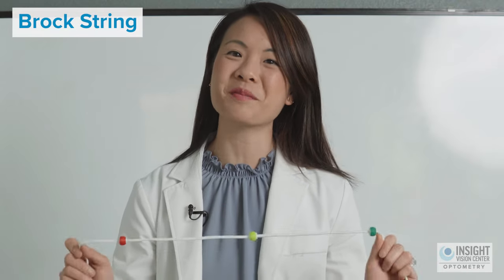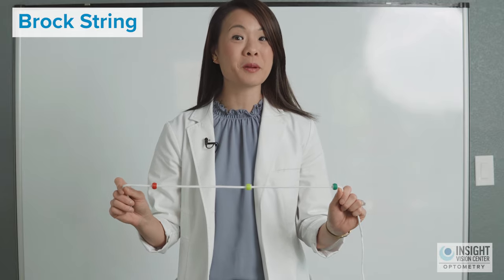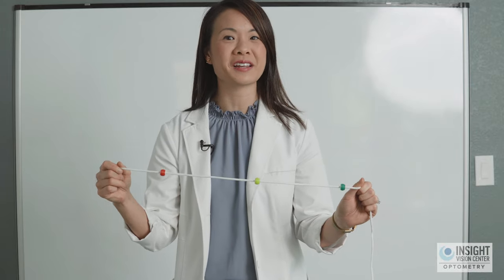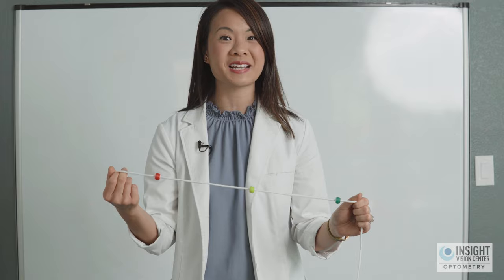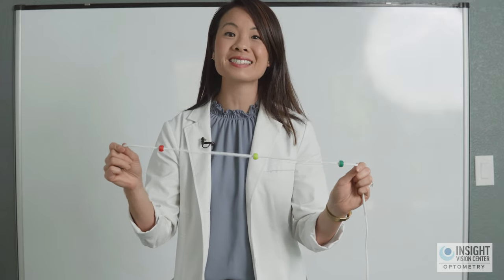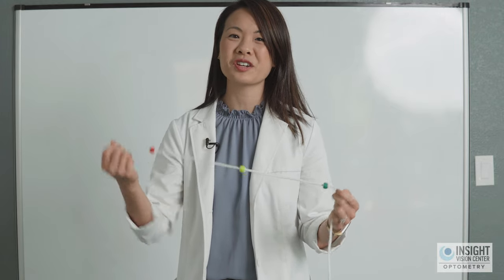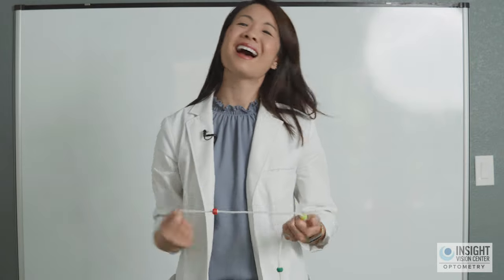I have here a medical grade Brock string made by the company Emergent. It's fantastic for several reasons. First, the tautness and elasticity of the string actually matters — having it too elastic or bouncy can be distracting. Second, the diameter of the beads: when I tip the string, the beads don't slide off, which really matters when doing this exercise. Lastly, I have a magnetic clip to hold the Brock string at eye level.